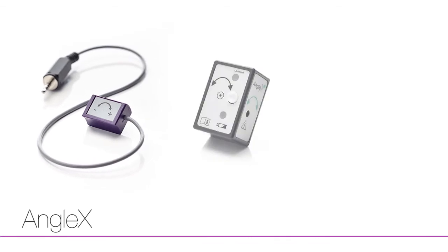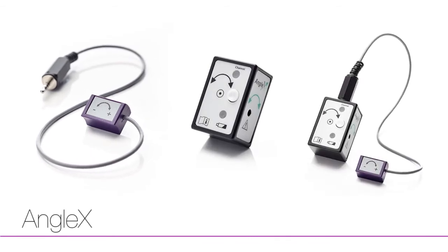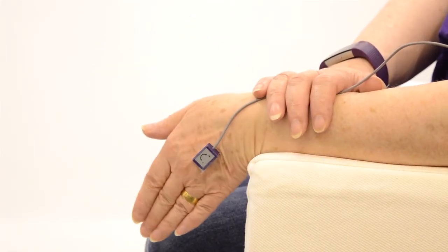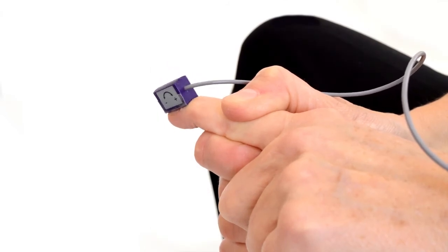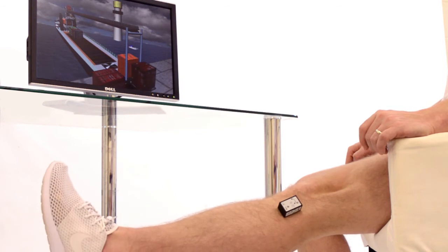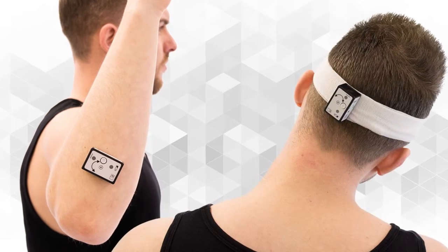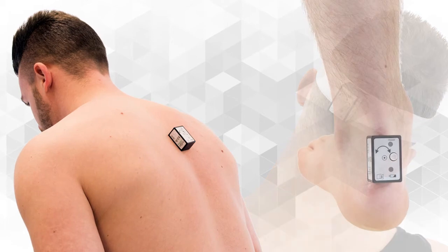Where there is some active joint movement — as little as 2 degrees — but not yet sufficient strength to grasp or move other devices, AngoX is the perfect rehabilitation tool. The sensors are simply attached close to the joint to be exercised with medical grade tape. AngoX then responds to active movement against gravity, providing focused exercise for joints in the upper and lower extremities as well as the neck and back.